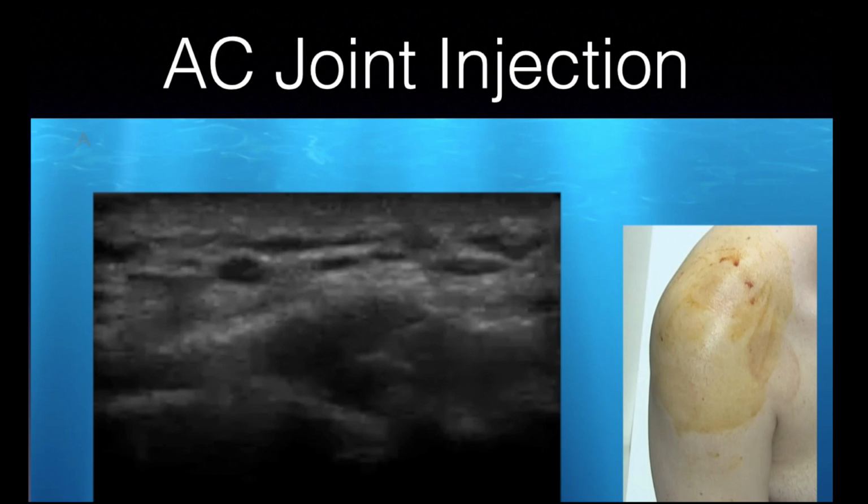And that's really the only lidocaine that I usually add. Maybe I'll add a little lidocaine at the end with the subdeltoid bursa injection, but to me, the less lidocaine, the better, but you need to use it at least for that initial stick. And just make sure that you know which syringe is lidocaine and which is saline when you go in initially.